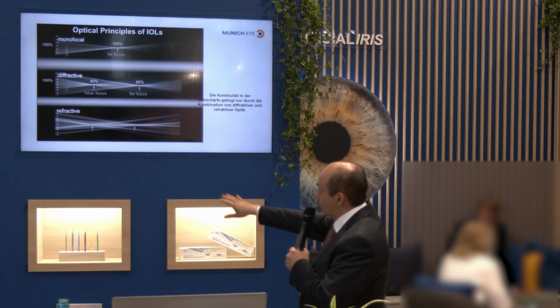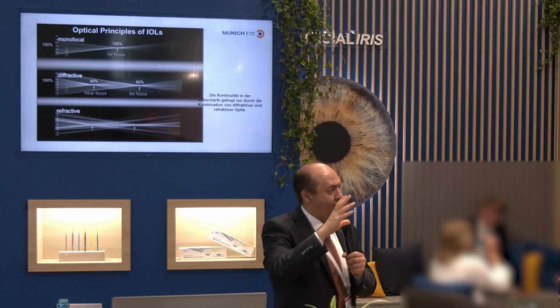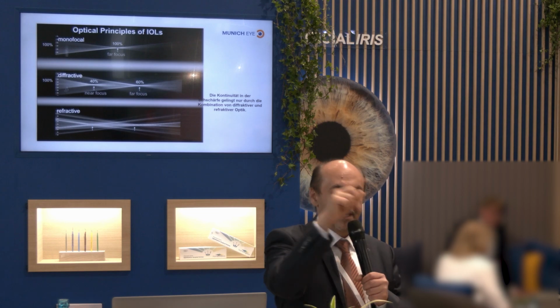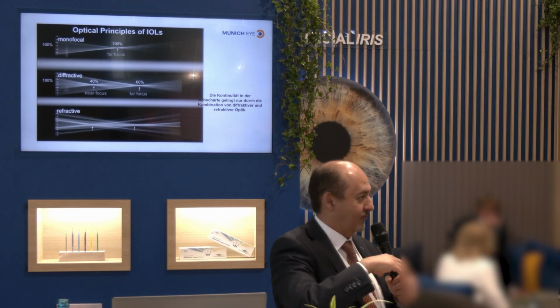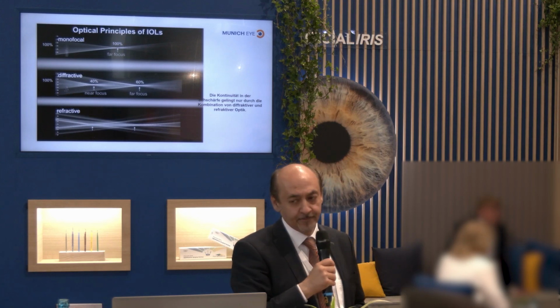However, in terms of light scattering patterns, with the refractive lens, when the pupil dilates, the light scattering is somewhat different. This is a bit of a disadvantage of the refractive lens because it doesn't provide geometric round circles and halos, which the brain can eventually adapt to, but rather diffuse light scattering, producing large light blobs. This is something the brain doesn't necessarily handle well.